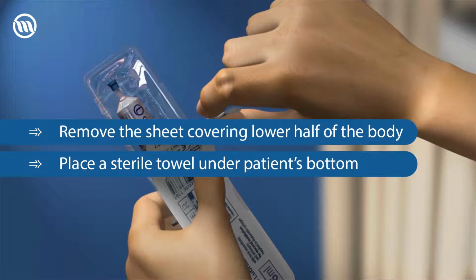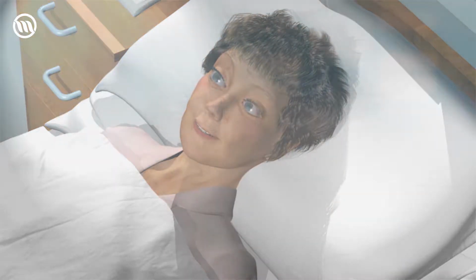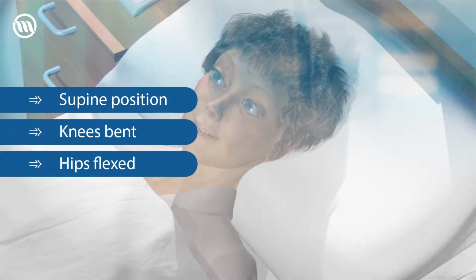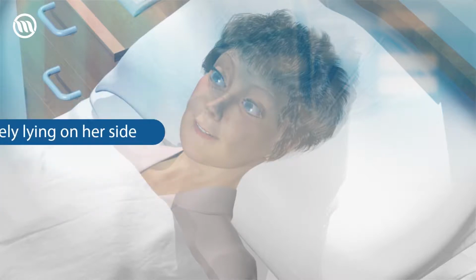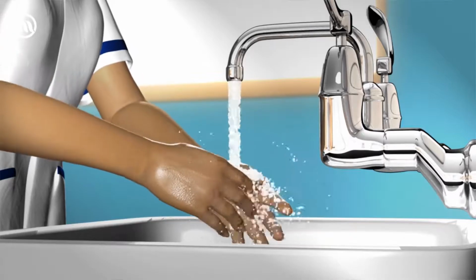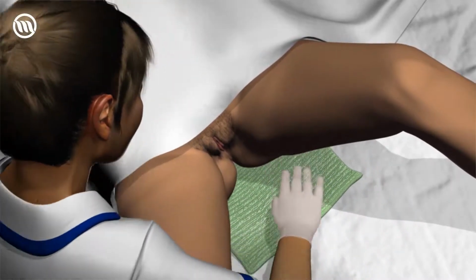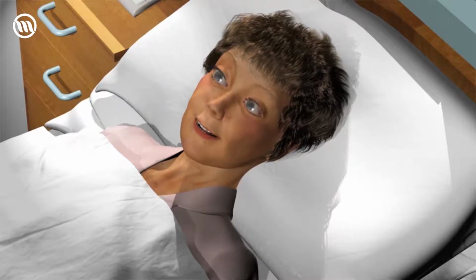If the patient's position has changed, ask her to get into a suitable position for you to carry out the procedure, helping if required. A supine position is usually best, with knees bent, hips flexed and feet about 60 centimetres apart. Alternatively, it may be easier to catheterize the patient with her lying on her side. Wash your hands and put on a pair of sterile gloves. Place a sterile towel between the legs to create a protective field. Remember to reassure the lady and explain each step of the procedure to ease any anxiety she may be feeling.